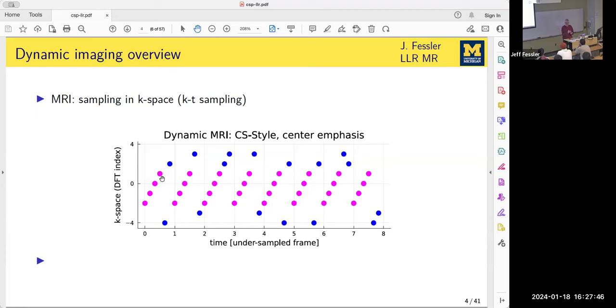And so I think we can study those waveforms and figure out what there is. So yes, I think there's an approximate notion of a band limit there, that this is good enough. And we have that in fMRI as well. We know what the physiological noise fluctuations from the heart and breathing are, and how fast we need to sample in order not to alias too much of that. It's a great question. I don't remember who's next, but I'll go with you.